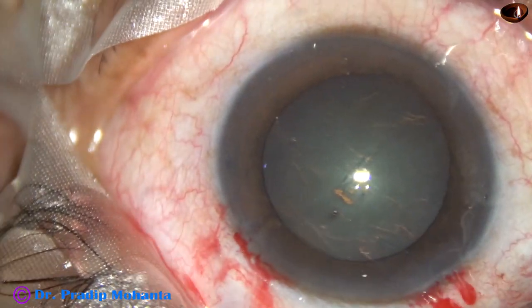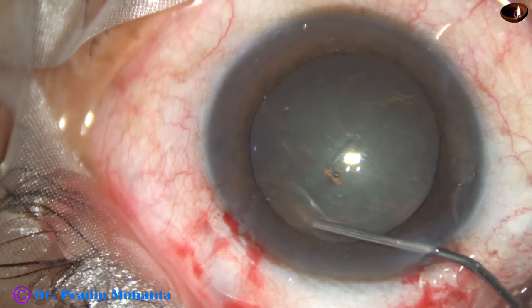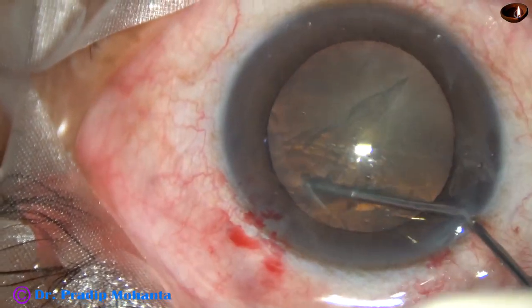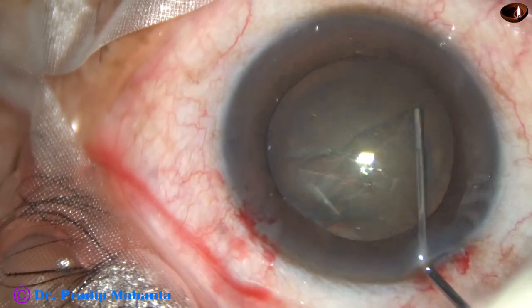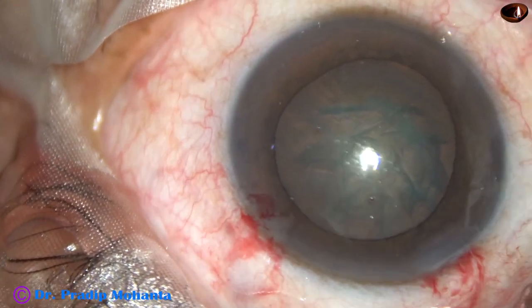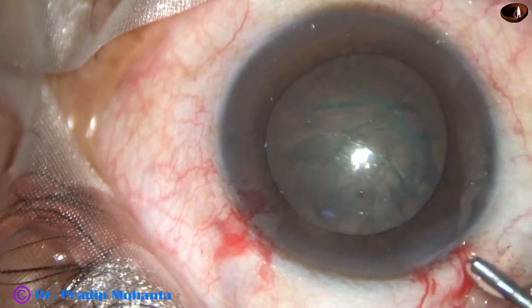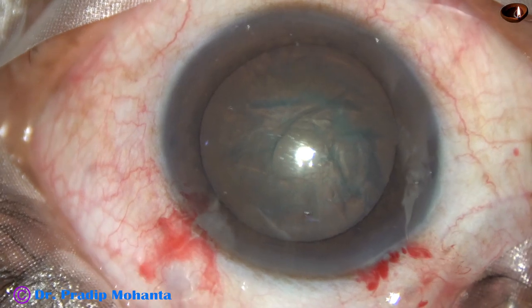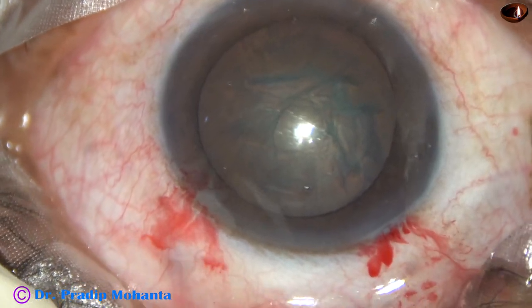Now, hydrodissection is done. BSS is passed just under the anterior capsular rim. The fluid wave goes to the opposite equator. The nucleus is rotated. 2% HPMC is injected again into the anterior chamber.